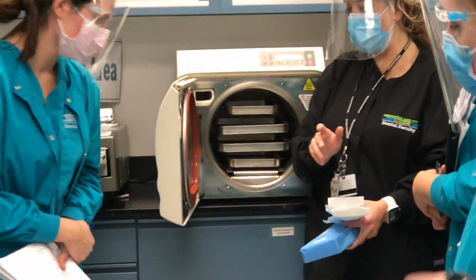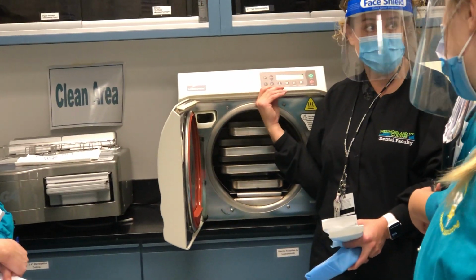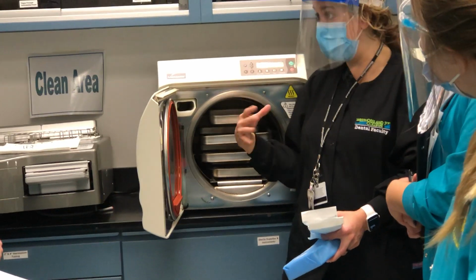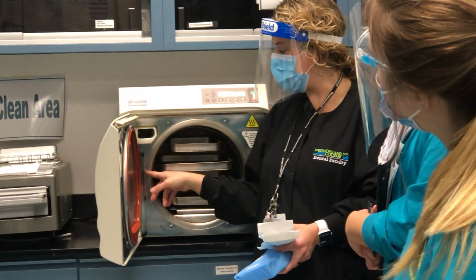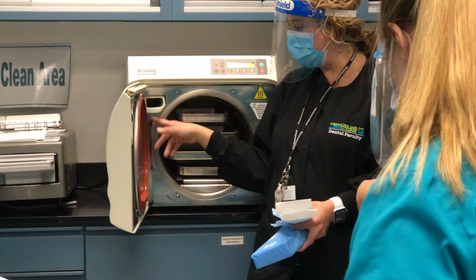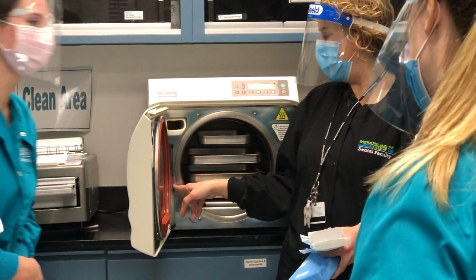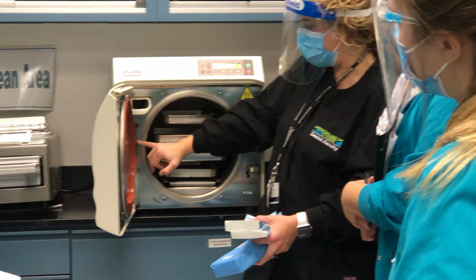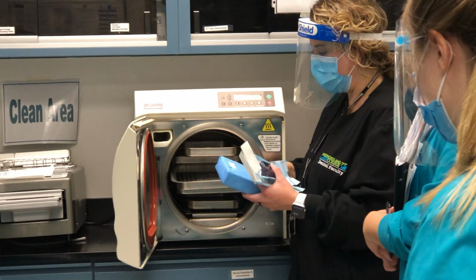A major thing that you wanna check and maintain is the water level, because this is a steam autoclave. So if we run out of water, guess what happens? It overheats and fries basically everything that's in there. So you wanna make sure there's a lot of water. So this is our green safe level right here, and then the red. So we're right about here, so we're in the safe level, and I think I showed you ladies this before, but I just wanna confirm that you keep watch on this.